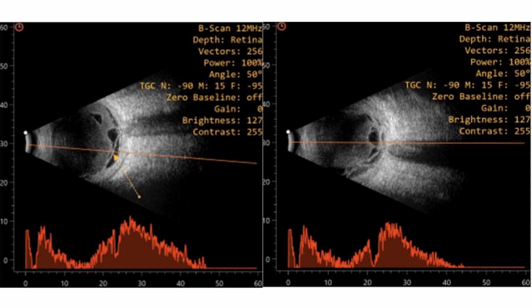Second thing, when you're suspecting retinal detachment, an ultrasound is showing a membrane, and you're thinking there's a retinal detachment, you can go in for surgery. So the ultrasound is going to give you a clue when to operate actually. Yes. So that's why we needed serial ultrasound.